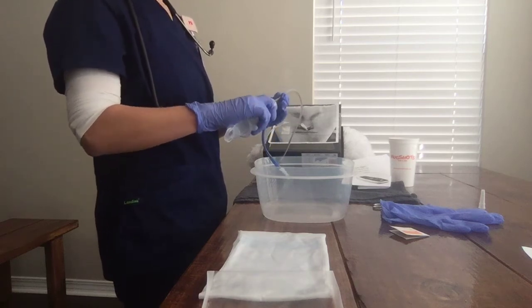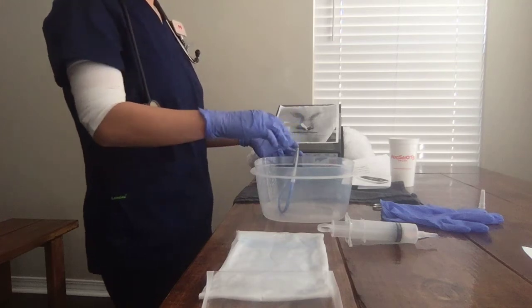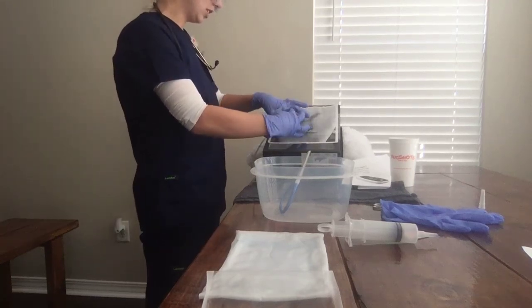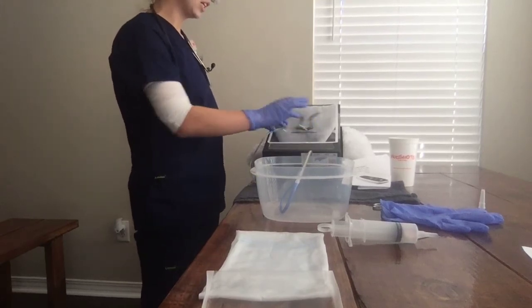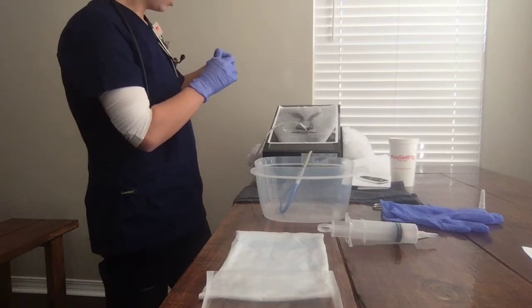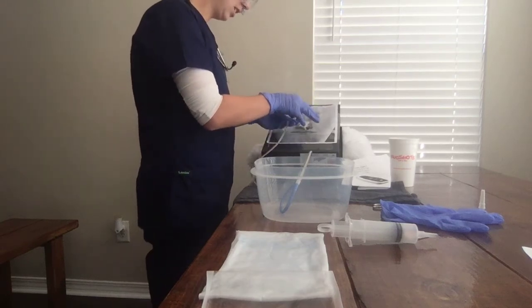So now I can remove this, cap this when it's not in use. And so now I am able to remove the temporary tape. I'm going to remove this, and I would prep the nose for the tape. So I prep the nose with an alcohol pad, and then I would tape to the nose, and we use the tape like this. So I would tape it to the nose, and then I would tape it to here.